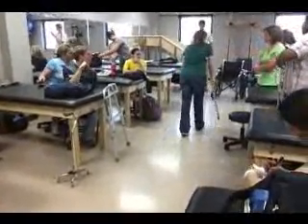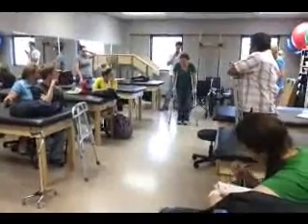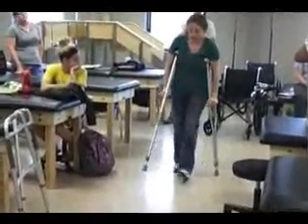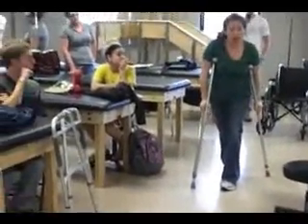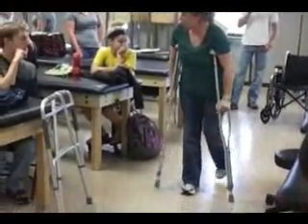Arm, leg, arm, leg. Now, if I have this, what gait pattern is this? 2-point. Why is it a 2-point? I'm advancing my crutch and my opposite foot at the same time. Exactly. That's the difference between the two. Okay? So there's my 2-point.